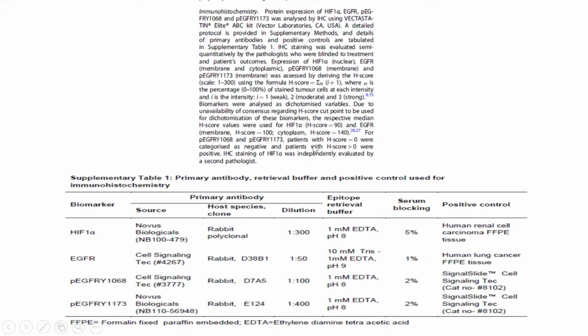Vaishnavi, how much is the subjectivity in this classification regarding the intensity? Precisely the question. Sometimes one slide is graded as weak by one pathologist and as moderate by the other pathologist. So we have to take a consensus call by both pathologists. This is work by my senior, Usha Patel. For the slides where there were discrepancies, she took them together, called both pathologists together, showed them at one go, and they consistently decided whether it was weak or moderate, and how much the percentage was.